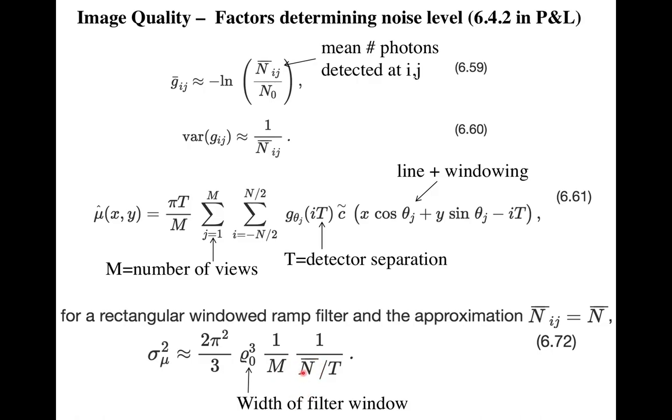Yeah? Is that limited by not wanting to burn out the sample? Correct. So the question is, in setting this, do you have to take into consideration what the sample is? If the sample is a live human being, you do have to take into consideration using more photons, because the more photons you use, the higher the dose. And that's a whole other aspect to this.